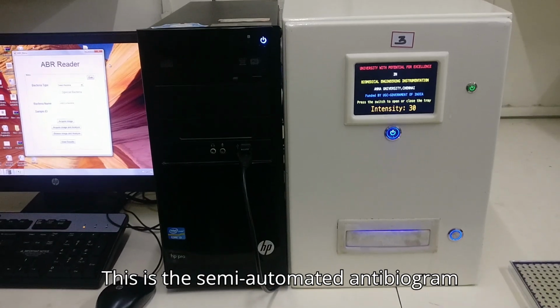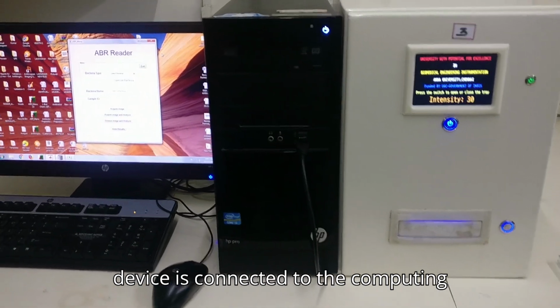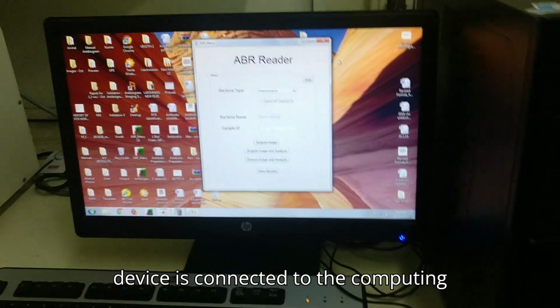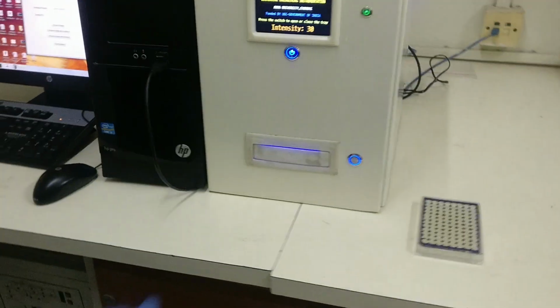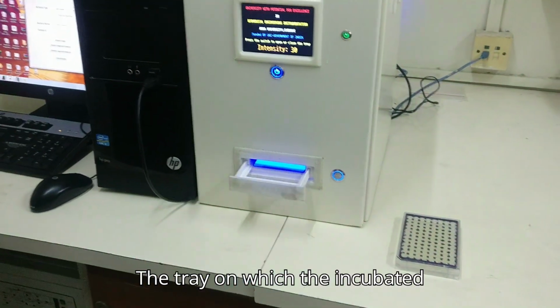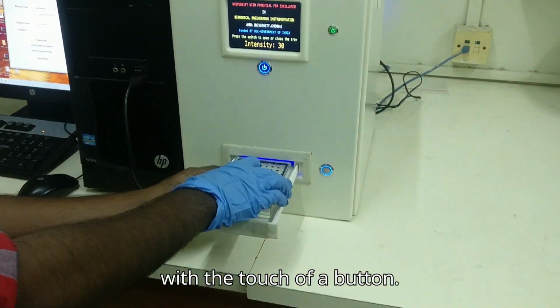This is the semi-automated antibiogram device. The semi-automated antibiogram device is connected to the computing device which runs the imager software. The tray on which the incubated antibiotic plate is placed works with the touch of a button.